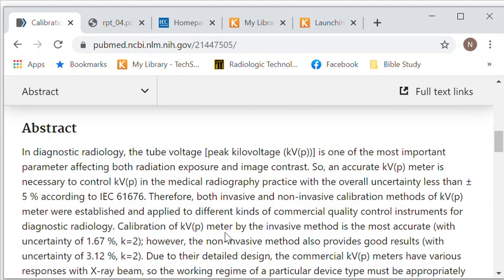Yesterday, when I recorded the previous slides on this, I said that the 5% is similar to 30% on mAs. If you underexpose or overexpose a patient by 30%, it's really not worth repeating. A 30% change is not enough to make a really good difference. That's your baseline for how to see a visible difference.